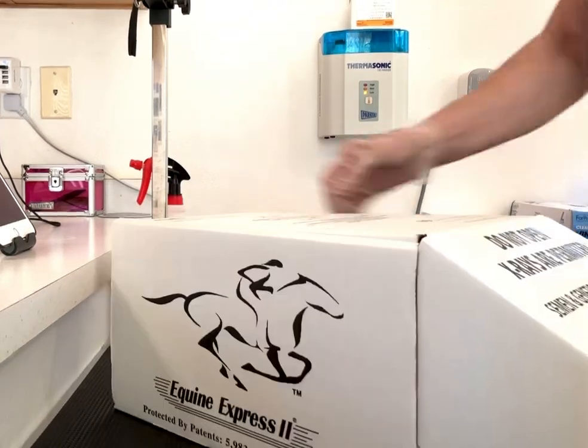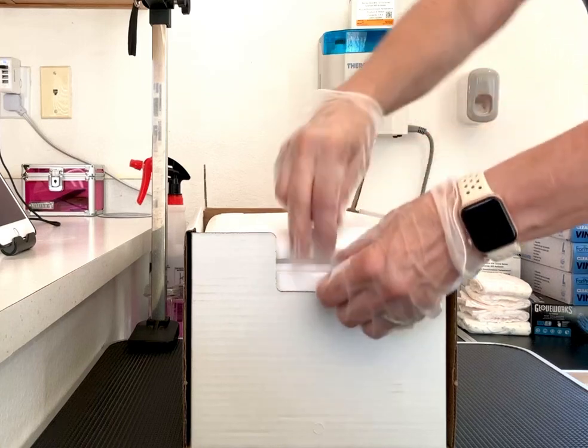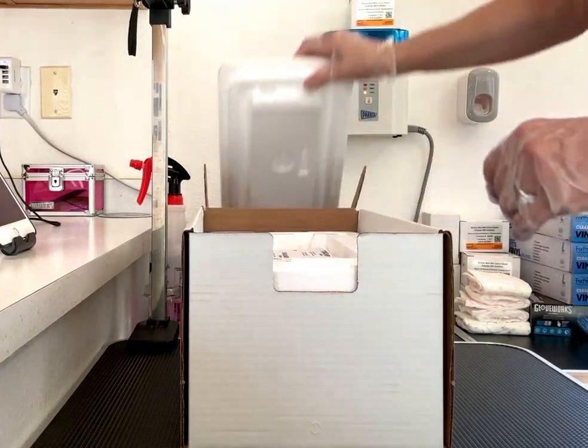This is the type of package that it will be coming in. Inside here, there's a styrofoam insulated container.